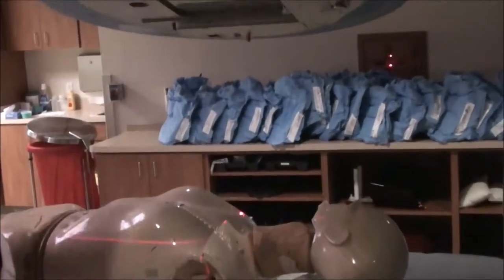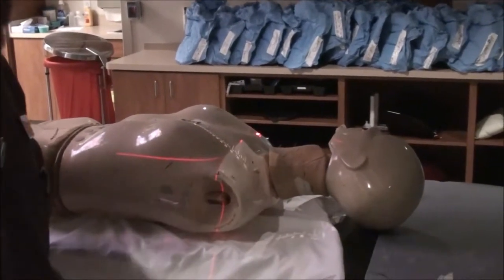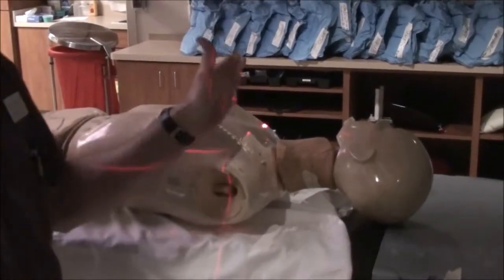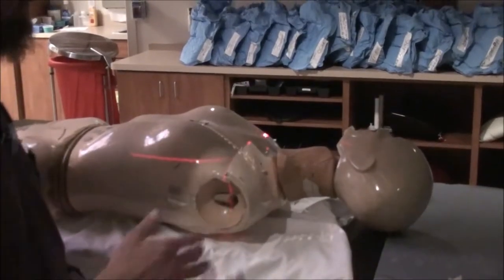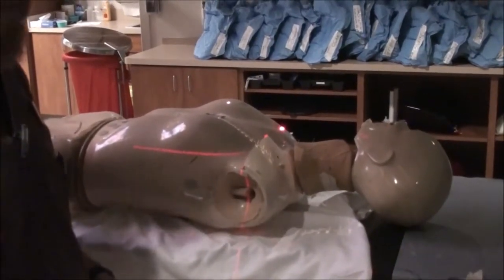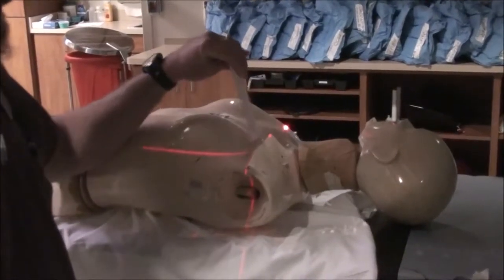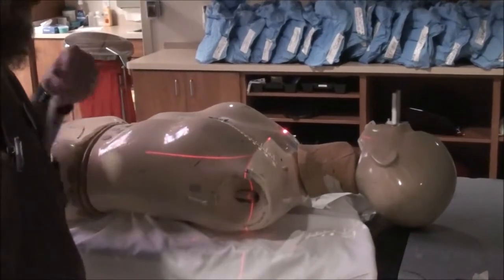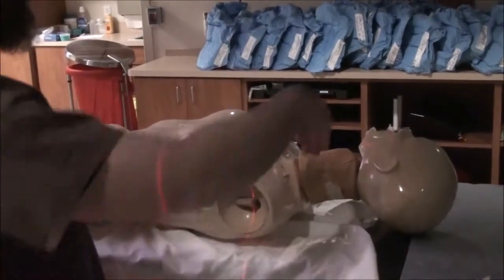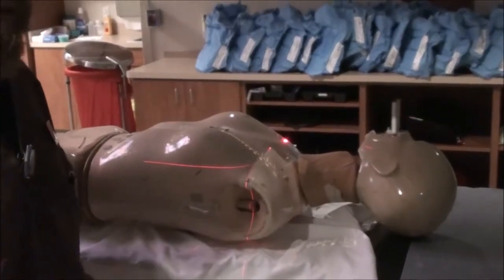I've got a 15-degree couch kick. I've got Y1 close to 0, Y2 open to encompass the field that we're going to treat. We start with the supraclav because this jaw being set to 0 is going to cause a non-divergent field. The inferior aspect of this field is going to be the inferior border — it actually falls at the CR. That's where the laser is. The jaw closed down to 0 creates a non-diverging beam. Rotating the gantry over creates less divergence on the lateral aspect that could diverge down into the throat and into the spinal cord.